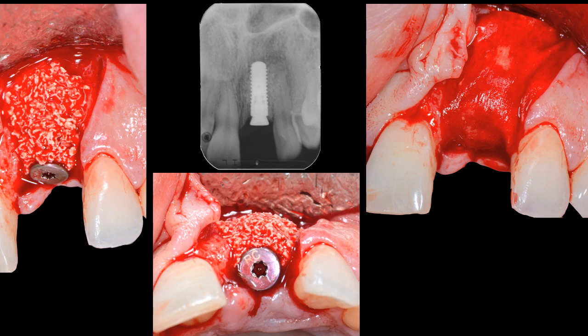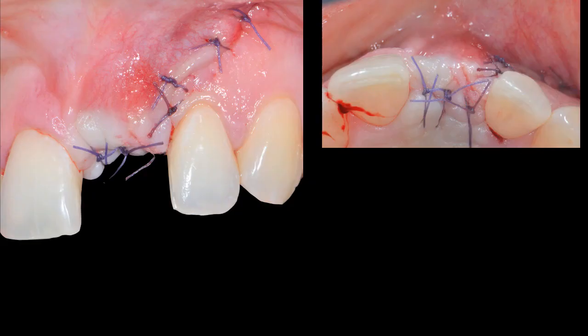The implant position is ideal, so palatally oriented, with a nice tilt towards the distal to recreate the zenith of that central incisor. The whole thing was covered by a collagen membrane to adequately complete the guided bone regeneration. The flap was then sutured hermetically with the 5/0 vicryl, and we allowed the whole thing to heal for about 5 months.